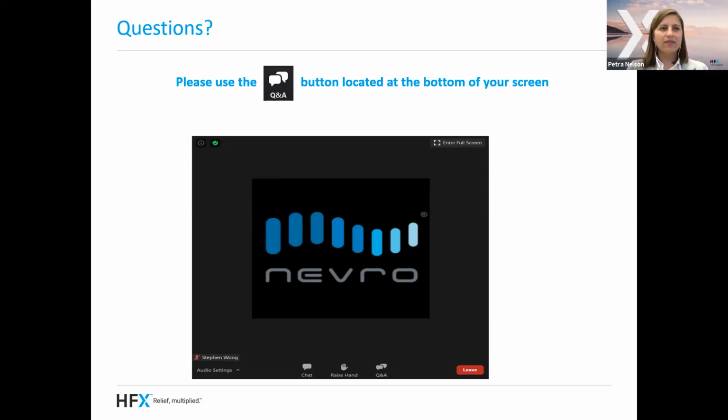Great, thank you. And then, covering the activity portion of it, because it is slightly different, could somebody swim with the device? I know temperatures are dipping, but it'll be summer soon again. Absolutely. Now, during the temporary test trial where there's tape and the wires coming out through the skin, I ask people to sponge bath and keep the tape dry and not go swimming until those temporary test wires are removed. After the permanent device is placed, I ask people not to submerge in standing water, including pool, lake, etc., for about 6 to 8 weeks until the scars are nice and tough and healed.